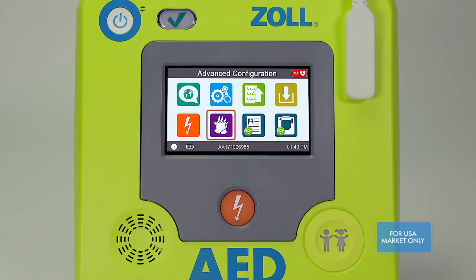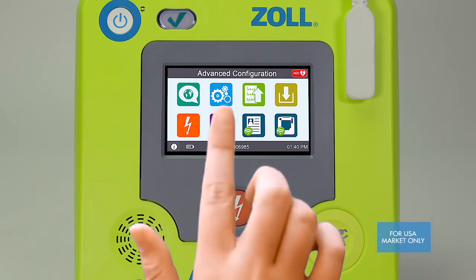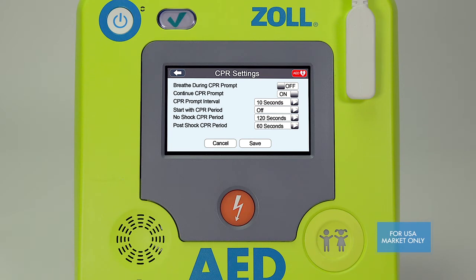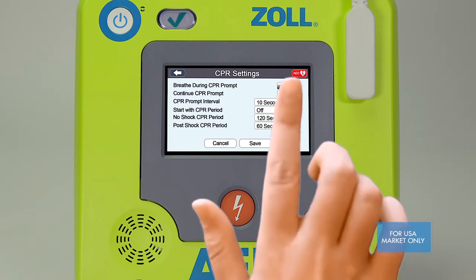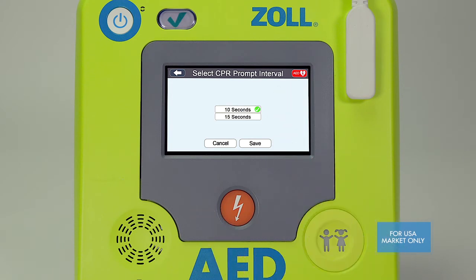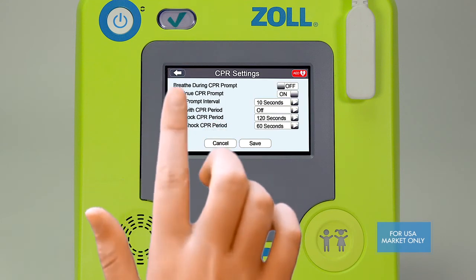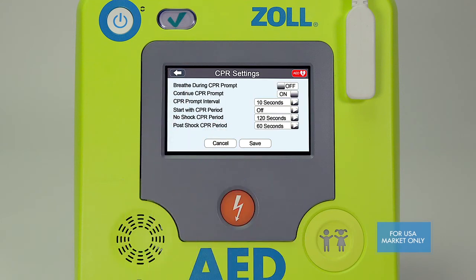The purple overlapping hands icon allows you to modify the CPR prompting and intervals based on your particular preferences and protocols. Factory default settings are based on the most current guideline recommendations and should be left in place for the majority of users. If you do prefer to change the setting, select the item you wish to modify by touching the respective option on the screen, choosing the prompt or interval setting you prefer, and then select Save.